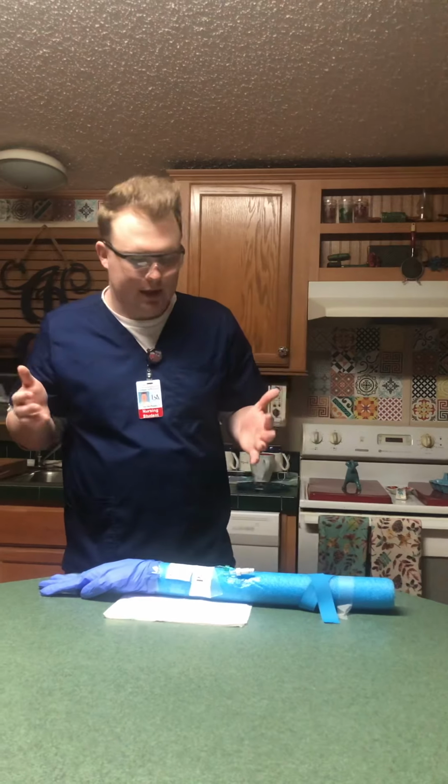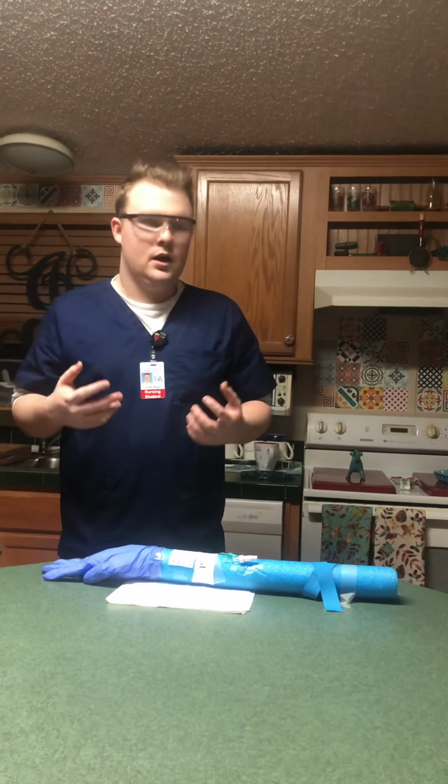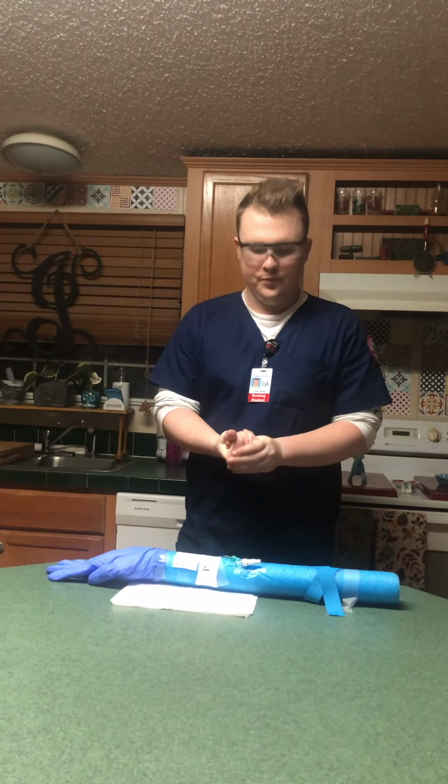And so I want to perform hand hygiene again, raise the side rail up, lower the bed, and inform my patient on how to not accidentally dislodge the IV and make it come out, and any complications of the IV, like infiltration, inflammation, and phlebitis. So I would inform my patient of all those signs and symptoms. So now I'm going to perform hand hygiene again as I'm leaving the patient's room. And I've already assessed them for comfort, and I'm going to document at the nurse's station.